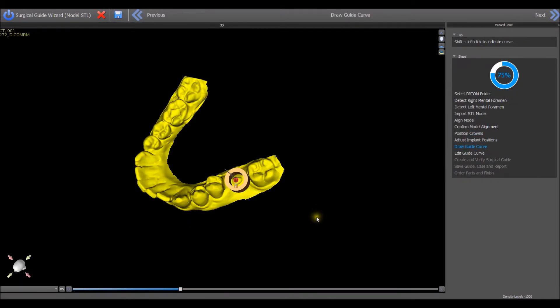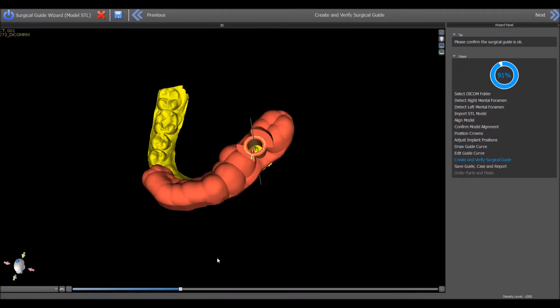The software guide tube and the surgical guide will be created with the relevant settings for the BioHorizons complete guided kit according to the implant selected.